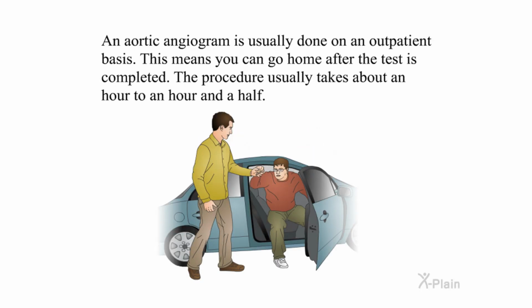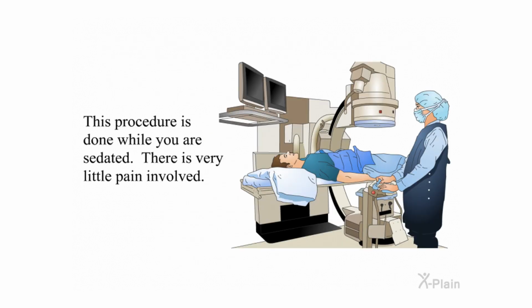Procedure. An aortic angiogram is usually done on an outpatient basis. This means you can go home after the test is completed. The procedure usually takes about an hour to an hour and a half. This procedure is done while you are sedated. There is very little pain involved.